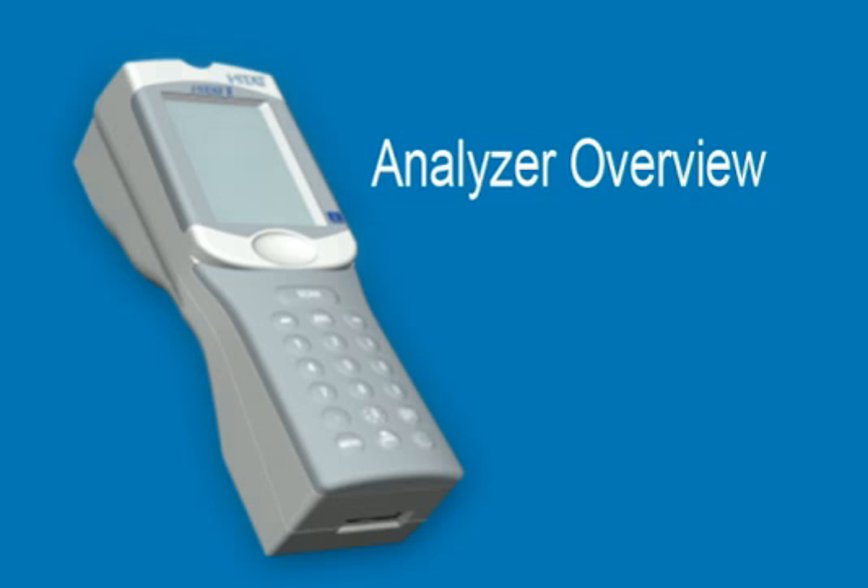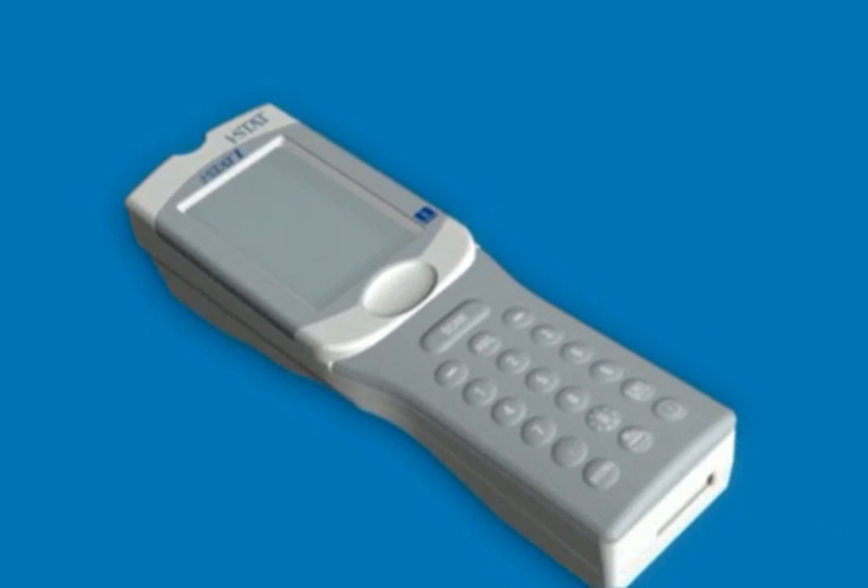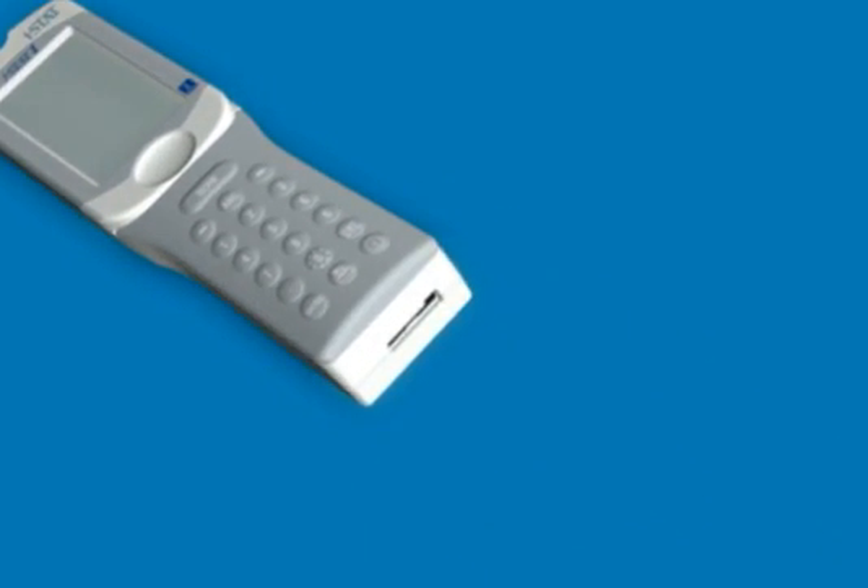Analyzer Overview. Abbott Point of Care has prepared this video as a reference tool to be used when training with the ISTAT-1 system.